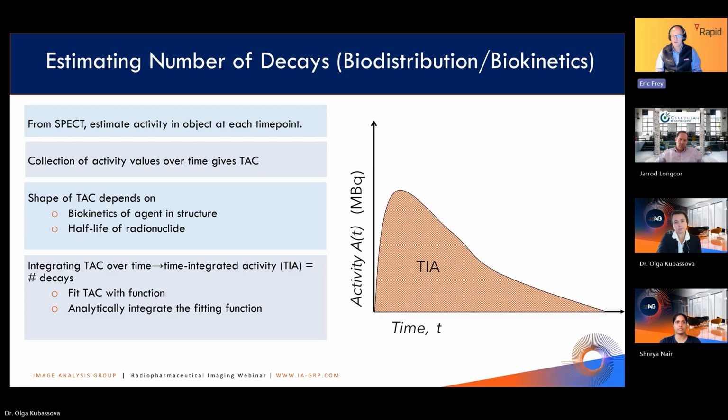And I think by understanding that, you can understand that you certainly would like to acquire some measurements of the activity at times along the latter portion of the curve. It's a little bit less important to measure the activities at these early time points, because there's less influence on the area under the curve by what happens in these early time points than the later time points.